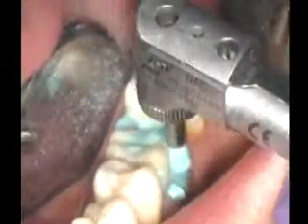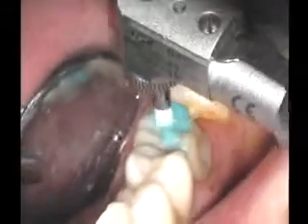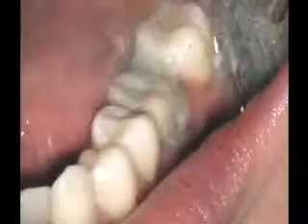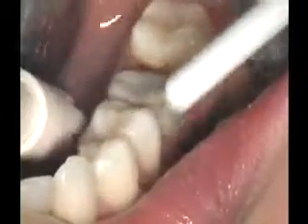After hemostasis is obtained, it's imperative to scour the surface thoroughly. An ULTRADENT ICB brush or rubber cup can be used with ULTRADENT's Concepsa Scrub for quality scouring and cleaning of the preparation. This scouring should be done prior to making the final impression and before final cementation of the completed prosthesis. If all hemostatic is not removed and the preparation is not thoroughly scoured clean, the bonding agents will not adhere to the dentin and/or enamel substrate.